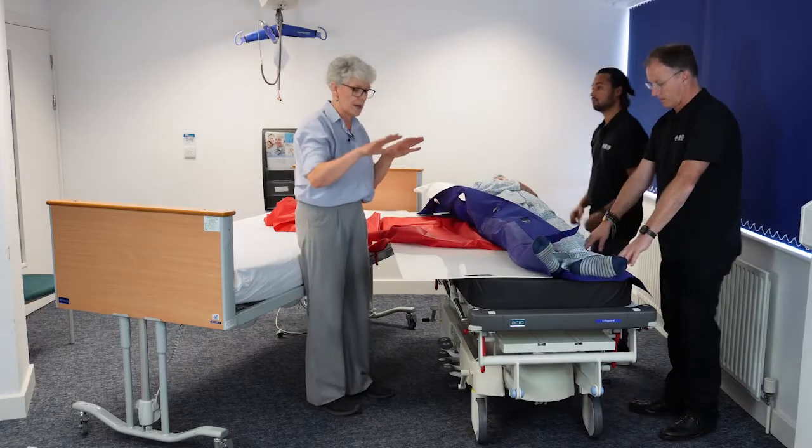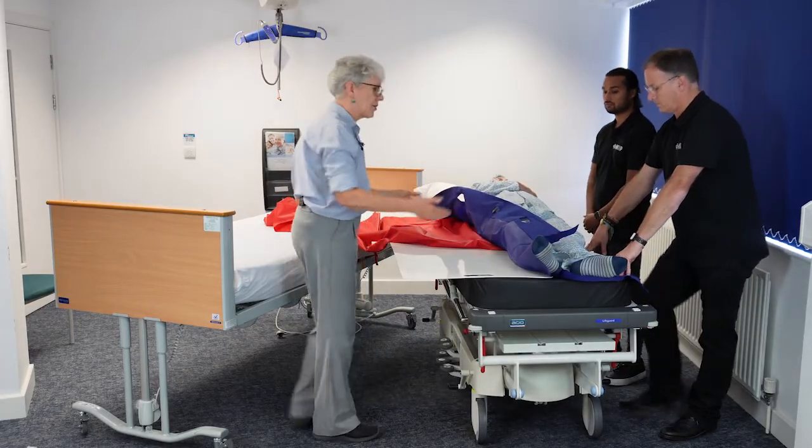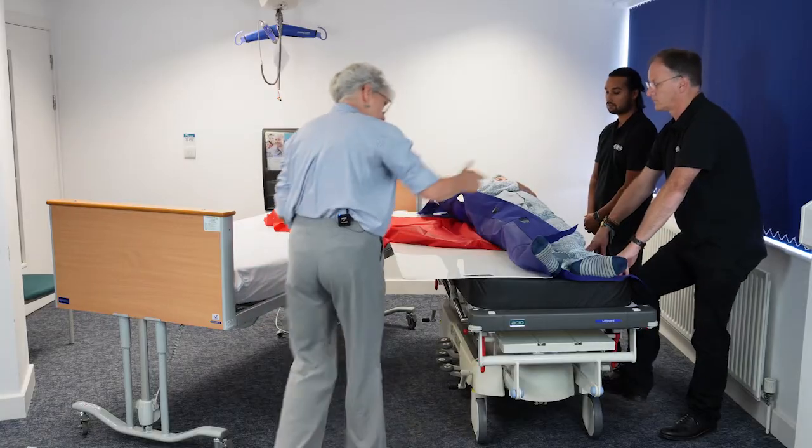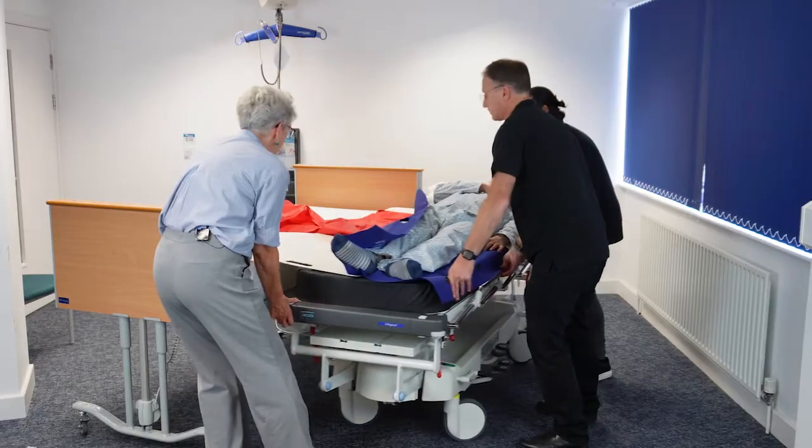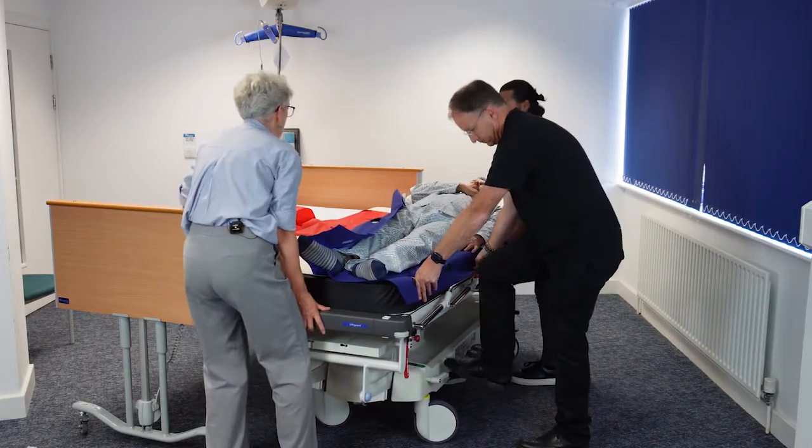Having positioned my transfer board and slide sheet, we're then going to bring the two beds together. Brakes off please. Let's just bring those beds together. Lovely — brakes back on.